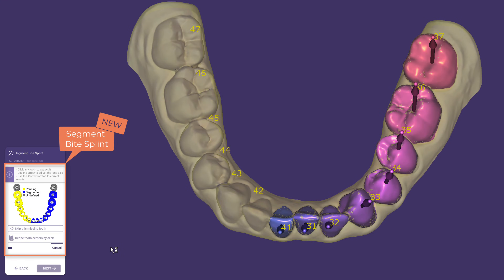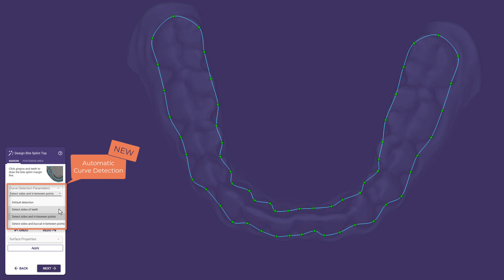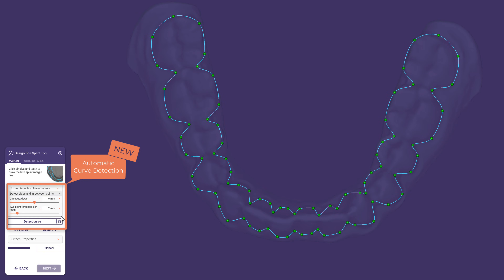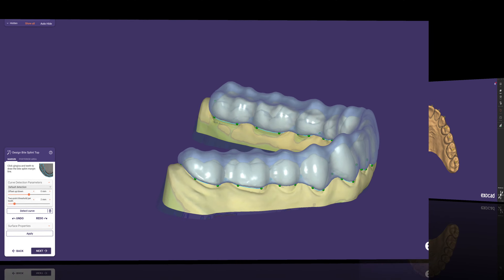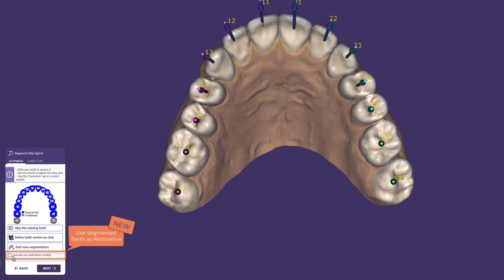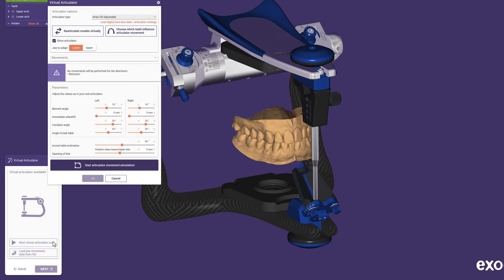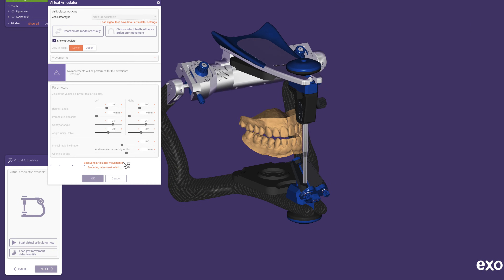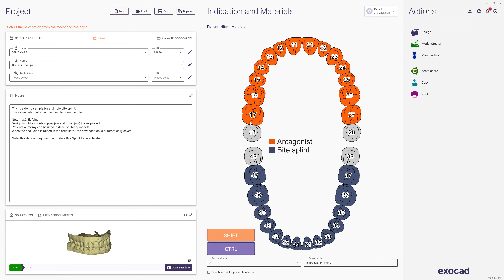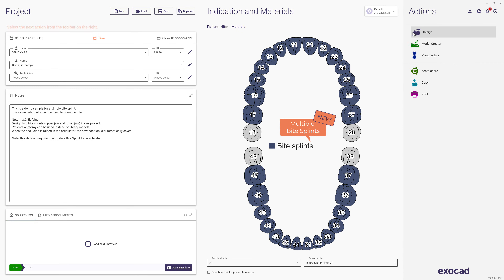The BiteSplint indication also benefits from multi-tooth segmentation, as the margin line will be automatically detected thanks to the new curve detection. You can adapt the draft to your preferences by selecting from a drop-down menu how many control points you need and in which area they should be generated. Anatomical BiteSplints benefit from segmentation too — you can now copy the original patient's anatomy into the splint instead of using library models. When occlusion is raised in the articulator, the new position is automatically saved. You can also design upper and lower jaw bite splints in one project simultaneously.